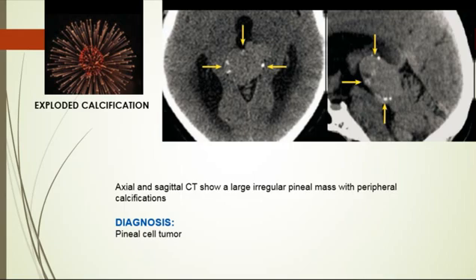Okay, the germinoma tumors tend to engulf the calcification, while the pineal parenchymal tend to explode or outward displace the pineal gland calcification. Okay. Pineoblastoma can be seen in patients with ocular retinoblastoma. They call it trilateral retinoblastoma, exactly, along with suprasellar primitive neuroectodermal tumors.